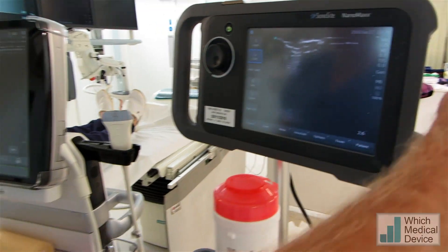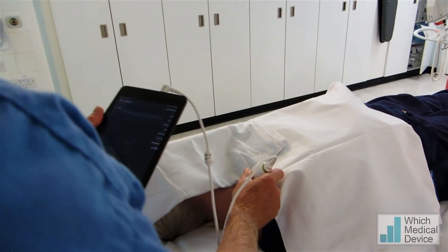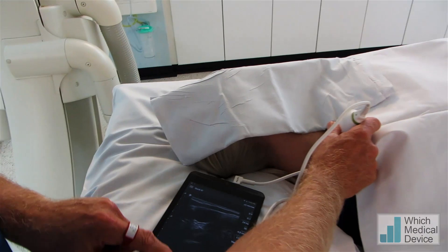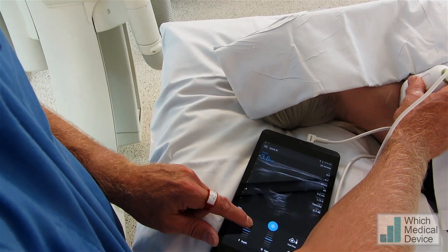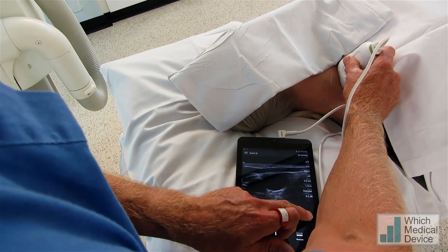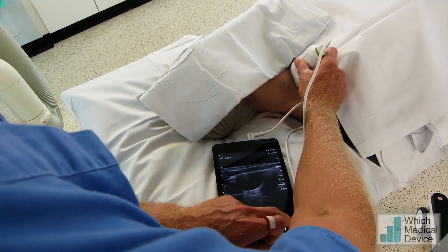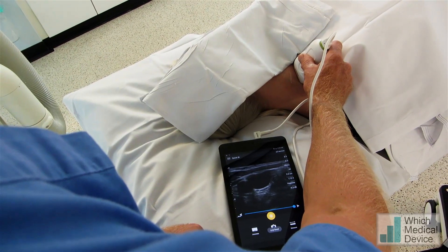Now if we just go back to the Philips Lumify again, which really is quite revolutionary given its size. And that actually is an absolutely superb image. I'm just going to rest it down and we can adjust the gain just by sliding it up and down. The depth — bring the depth up, depth down — freeze the image, scroll backwards and forwards. We can capture the image and capture cine loops as well. If we save loop there, that will save a cine loop for us. That's the loop saved.